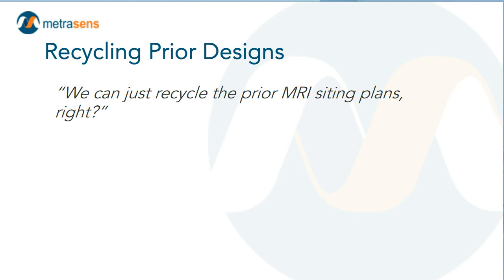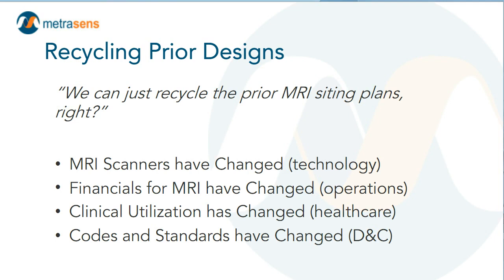MRI scanner technology has changed rather substantially in the last 10 years, certainly over the last 20 years, and lots of the vendor templates really have not undergone a significant update based on any of these factors in 20, 25 years. So we have changed the MRI scanners.